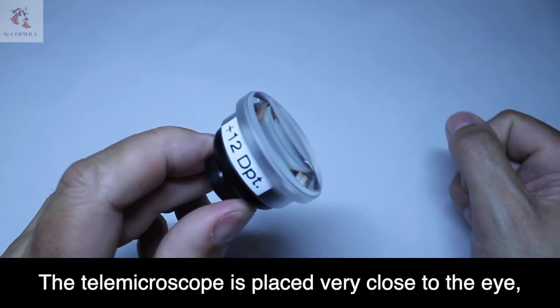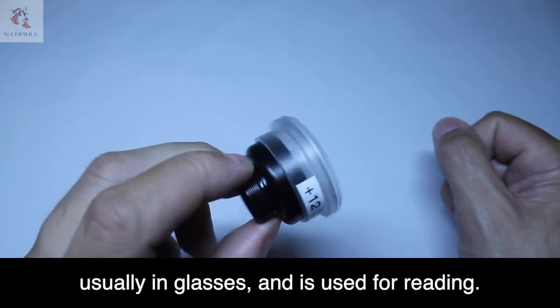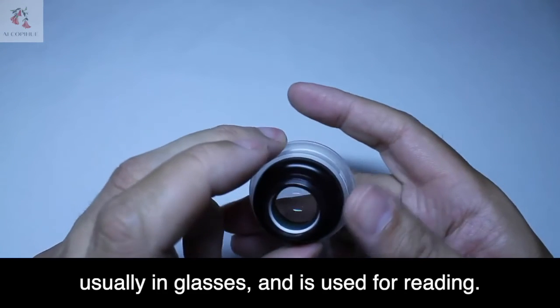The telemicroscope is placed very close to the eye, usually in glasses, and is used for reading.